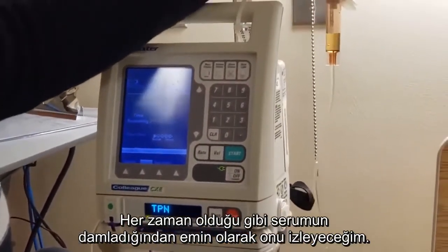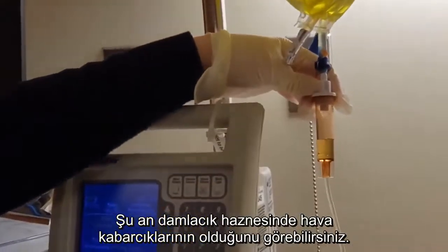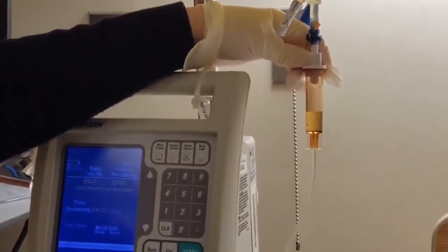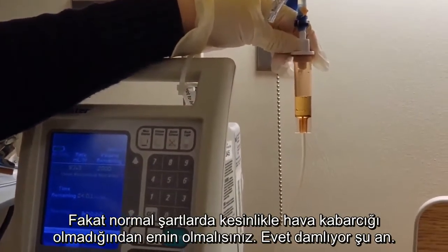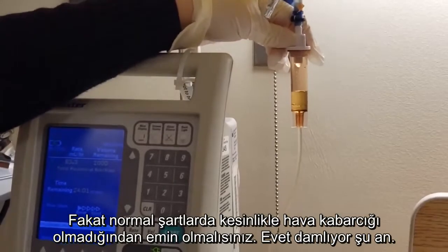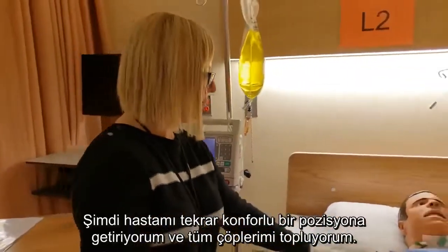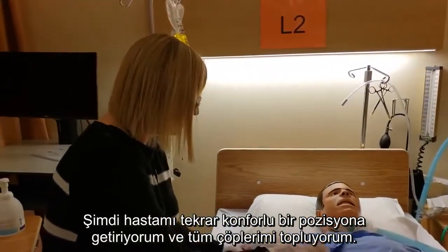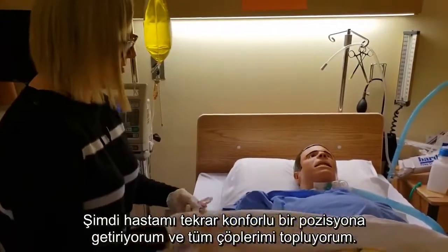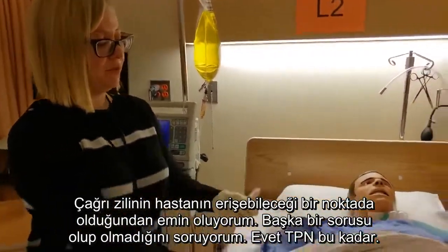As always, I'm going to watch and make sure that it is in fact dripping. You can see some air bubbles coming up in there, but in reality I would have made sure there were no bubbles inside. And it is dripping. So I would make my patient comfortable again, get rid of all my garbage, make sure his call bell is in reach, ask him if he has any further questions. And that would be TPN.